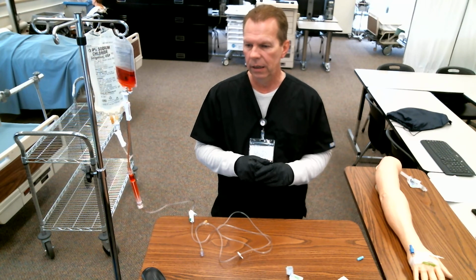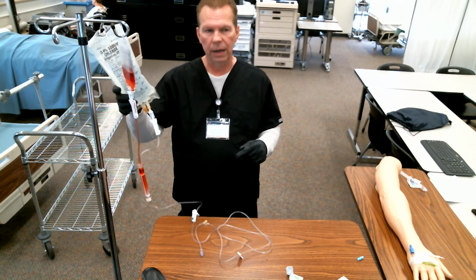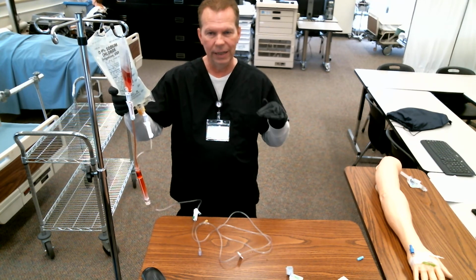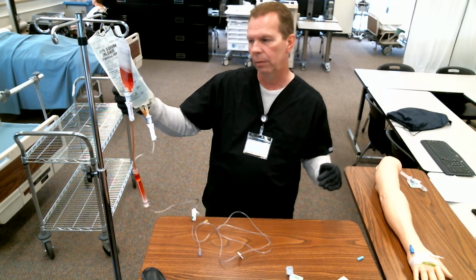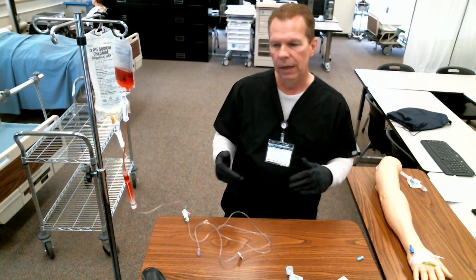Okay, let me hit a couple more things. Only hang blood with saline, nothing else, okay? Never hang blood with anything else. It is not compatible with anything else. It will cause problems. So normal saline is the only thing you can hang blood with.